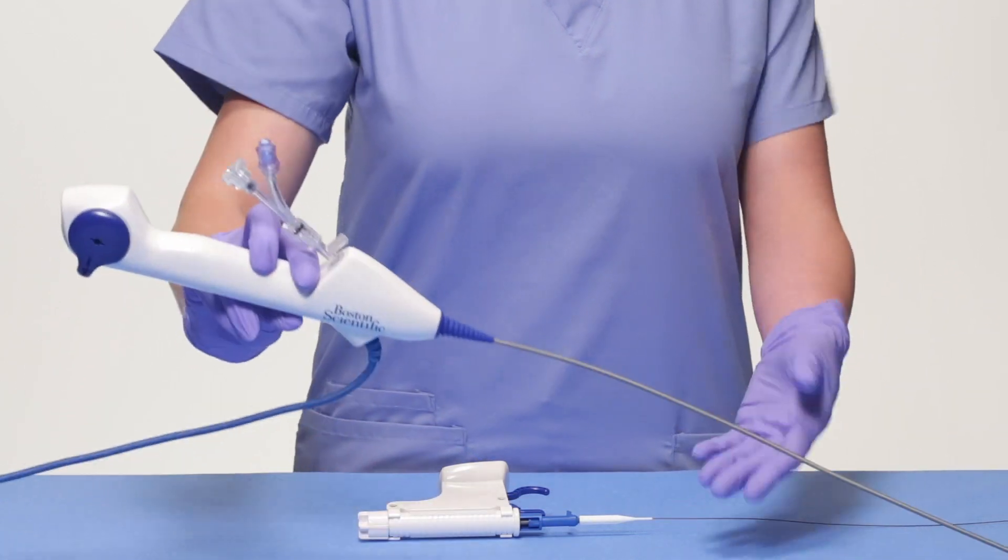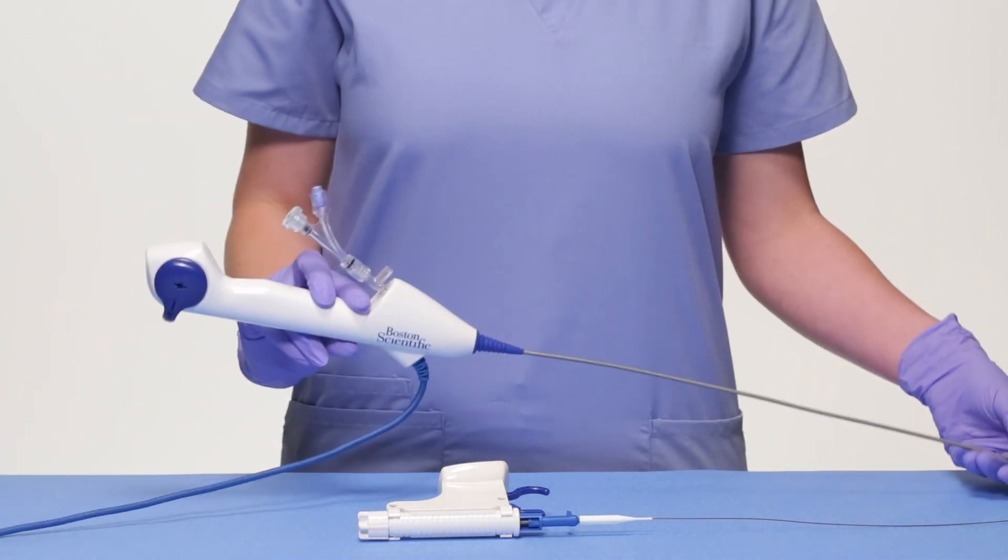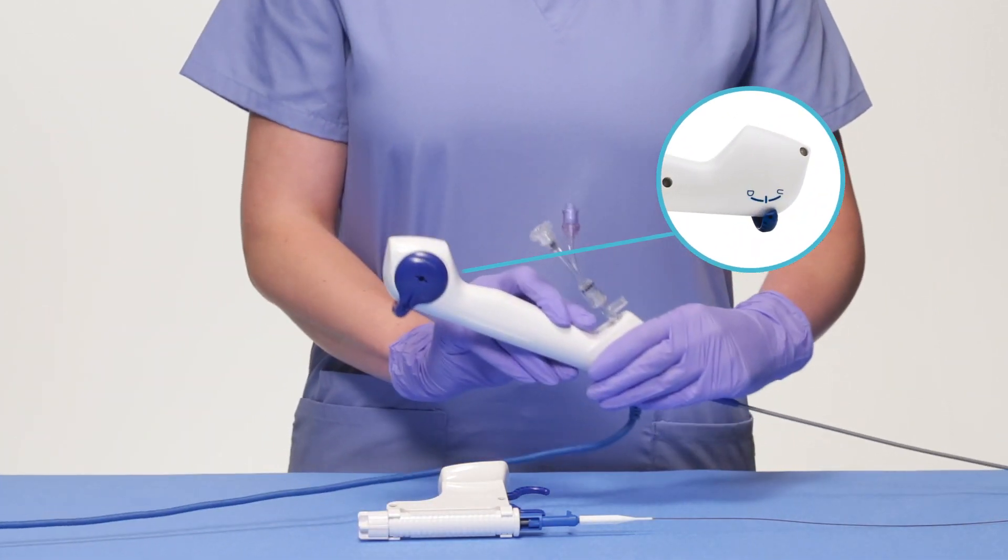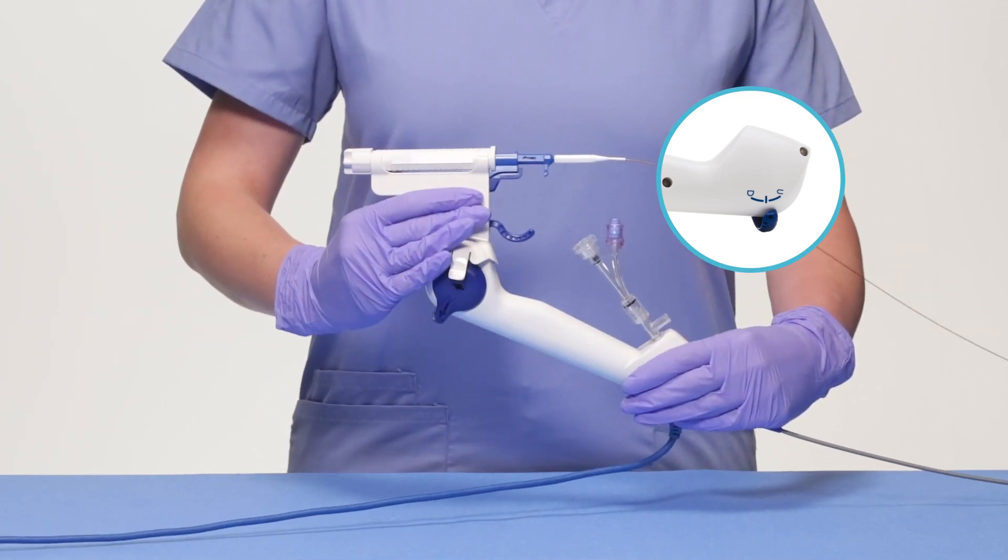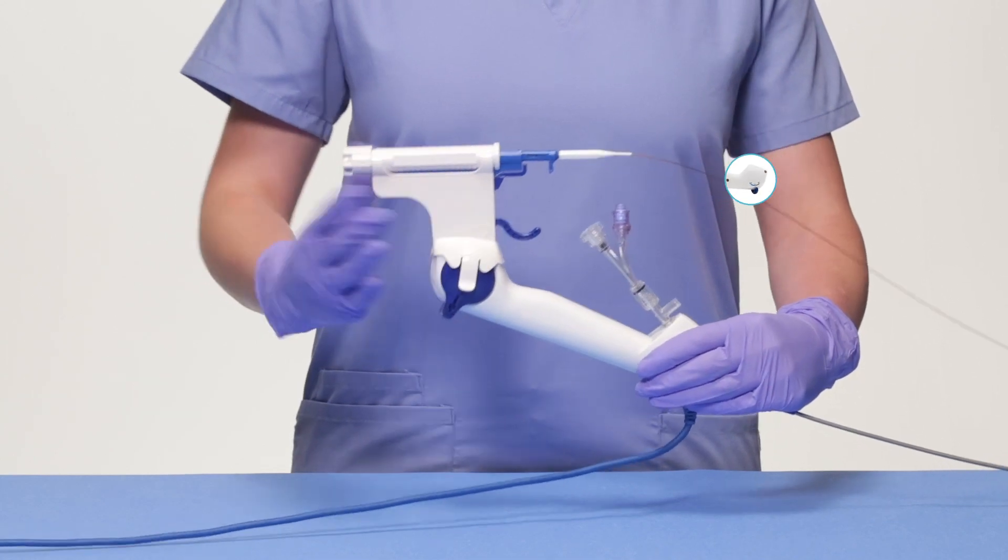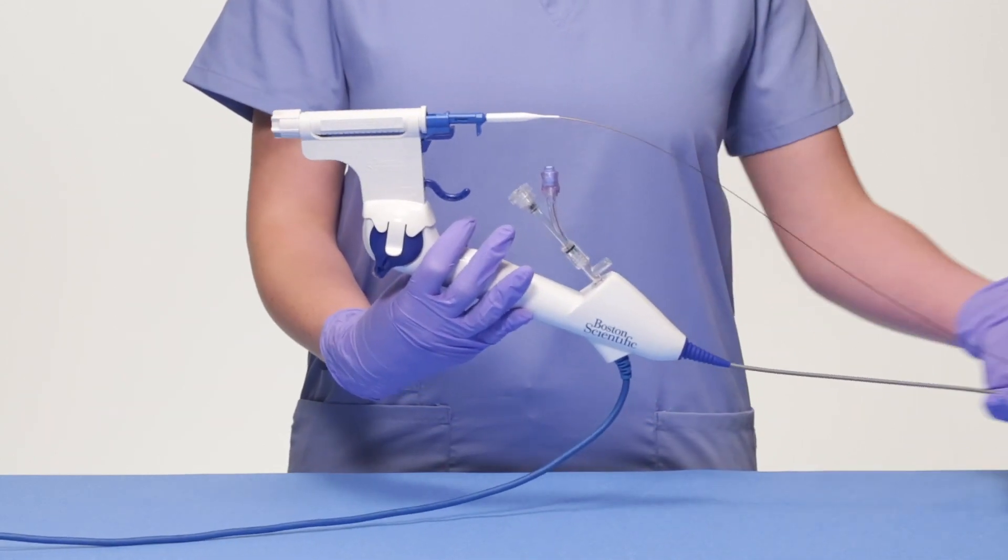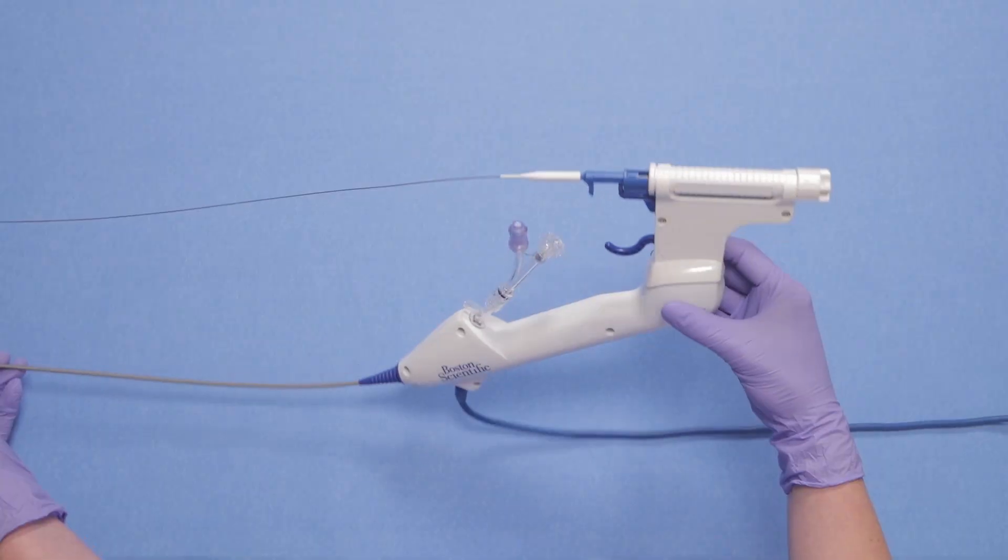To connect the Lithaview Empower Device to the Lithaview Ureteroscope, you must first align the pin with the DU markers on the ureteroscope. This side must be attached first for the device to function properly. When aligned correctly, pressing down will snap the device into place.